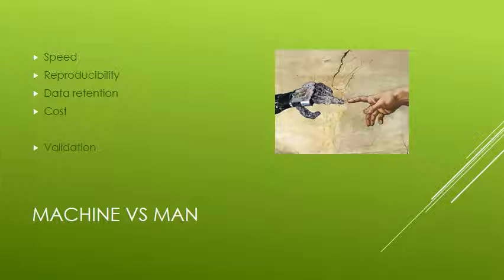The limiting factor in microbiology, of course, is the fact that the bugs have to grow, right? We can't make them grow faster. However, maybe we don't need to look at their growth directly. Maybe there are molecular ways that we can look at genes that are produced, proteins that are present, things like that, and get an ID by that method instead. So speed is something that's definitely still on the table for microbiology. It's always good that we can improve speed.